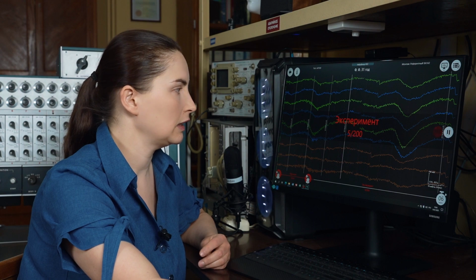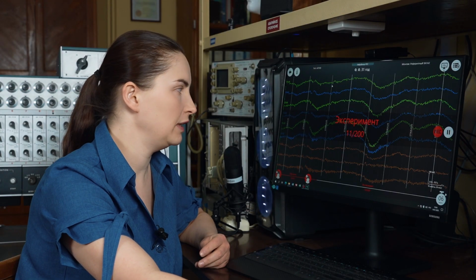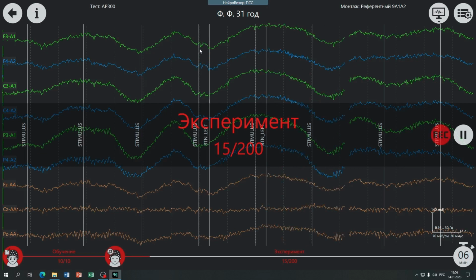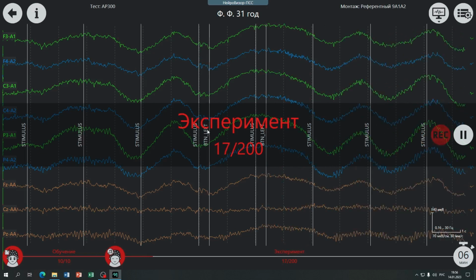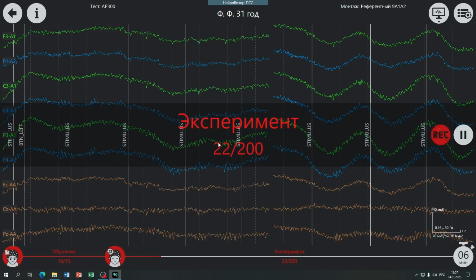They will not require a response, and they will be marked with single vertical lines, followed by the absence of a second mark, indicating that the button has been pressed. And only when the target, rarer stimulus appears does a second mark appear. It is the mark of hitting the left button on the patient's remote. This means our participant is carrying out his task.